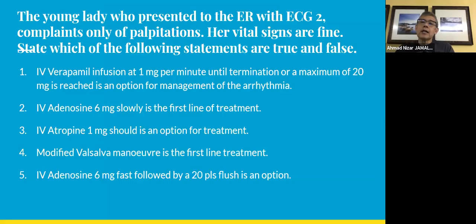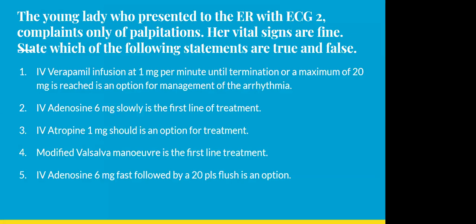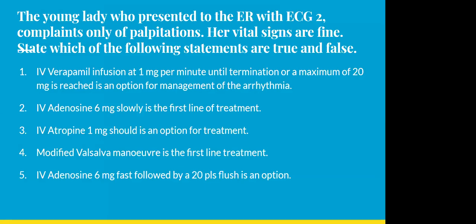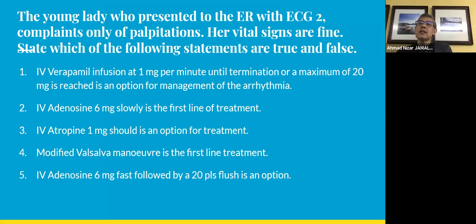Okay, this is the second question. Now, all your patients are ladies, huh? Because SVT is common in women. Yeah. The young lady who presented to the ER with ECG 2 complains only of palpitation. Her vital signs are fine. State which of the following statements are true and false.